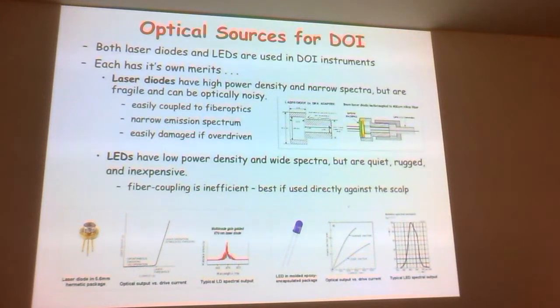For the optical sources that you'd use, you can use laser diodes and light emitting diodes. I've always used laser diodes myself because I like that they have a higher power density. It's easier for me to focus into a fiber. It's also more narrow band than an LED.